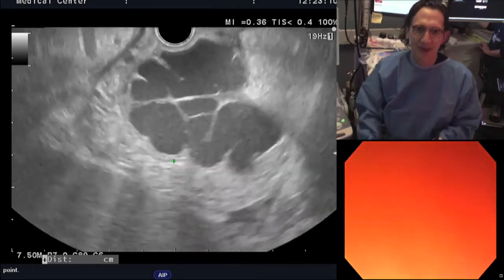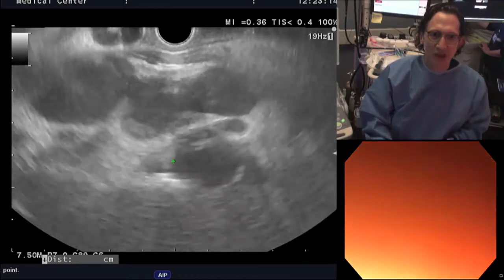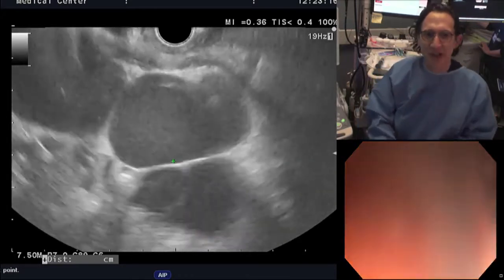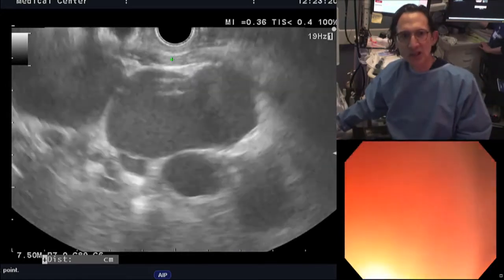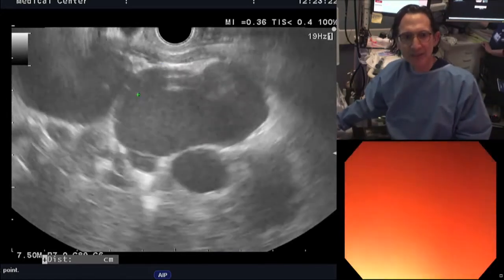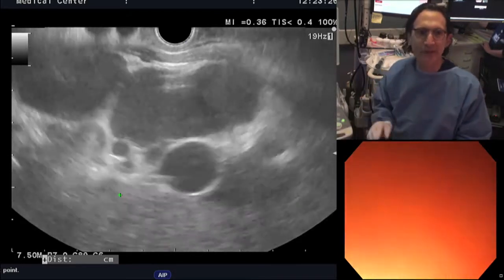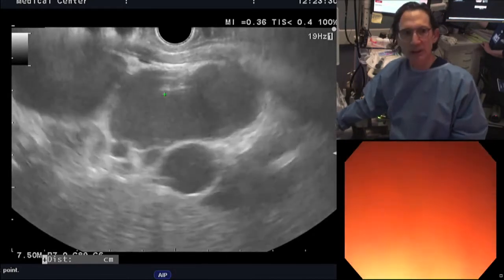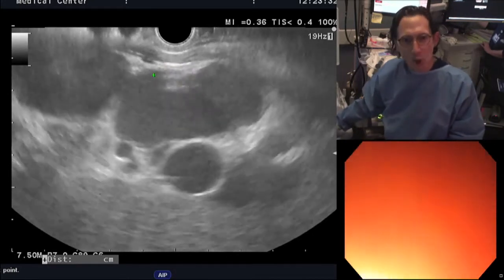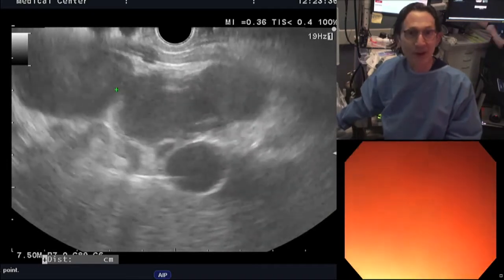We want to go here. Now the question is, can we do this transesophageal? What does that mean, transesophageal? Well, that means we're going from the esophagus, and this is the crus muscle, and the fundus is somewhere down here. Normally we see the fundus here, because it runs parallel to the distal esophagus. Normally I would show you the fundus, but we don't see the fundus.